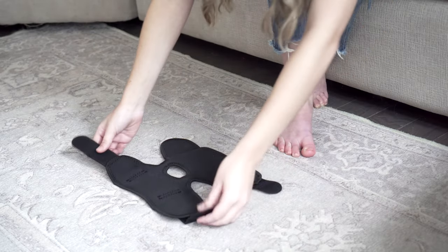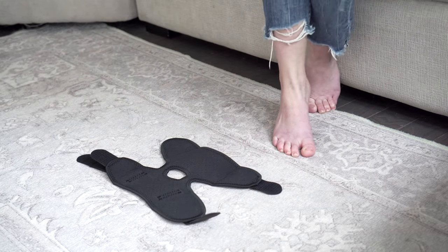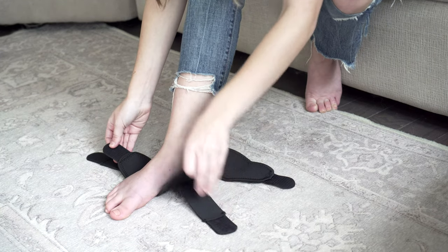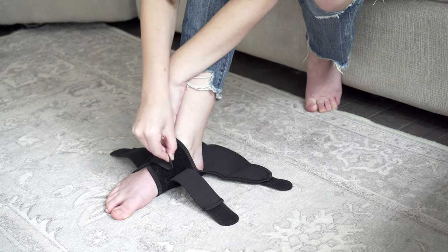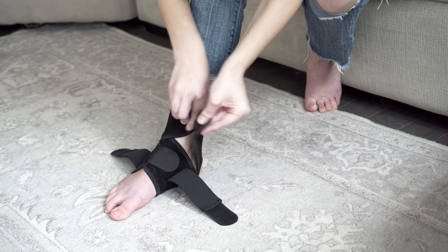First, lie the Bodyprox brace flat on the ground and align your heel with the open heel area. Attach the inner Velcro tabs across to the desired and comfortable fit. Secure the ankle brace by fastening the top strap.